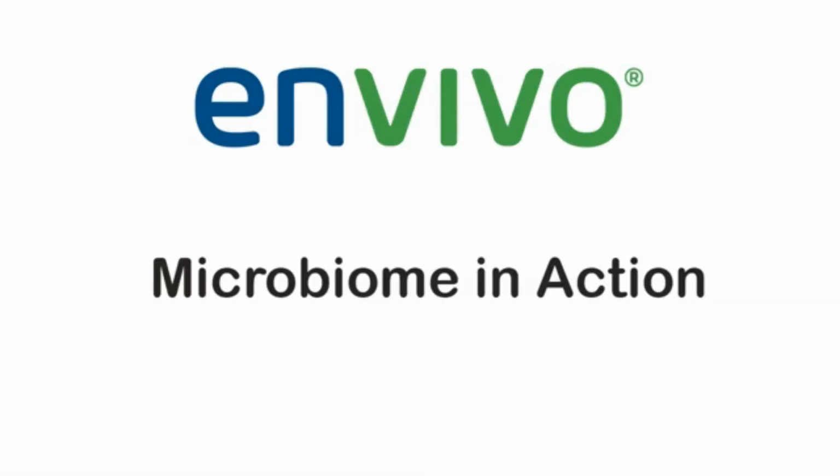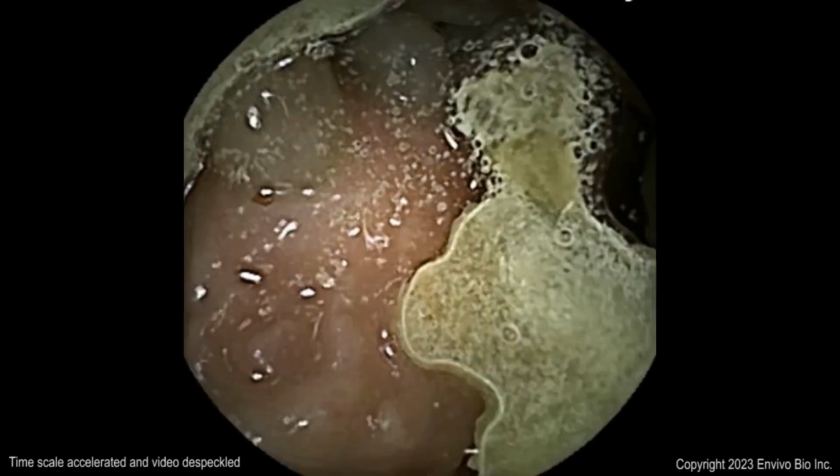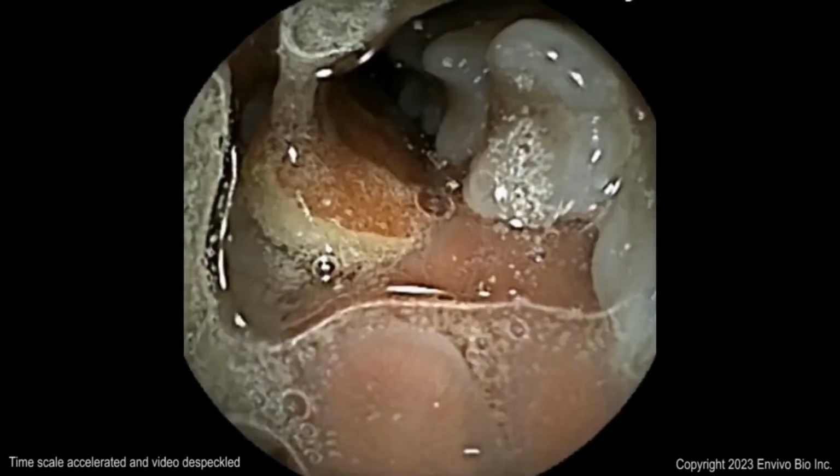As part of developing the CapScan gut sampling device, we recorded the microbiome in action and documented the sampling of the CapScan device using capsule endoscopy. The first part of this video shows an apple being digested.